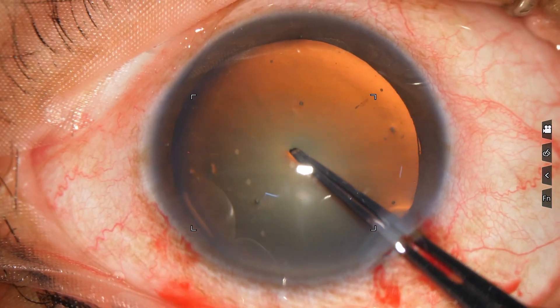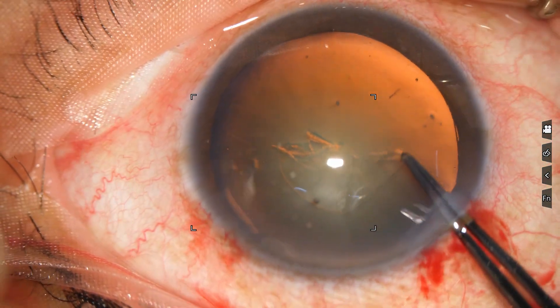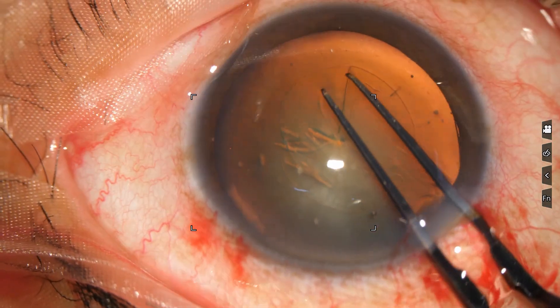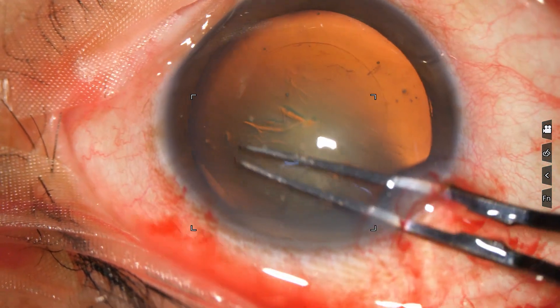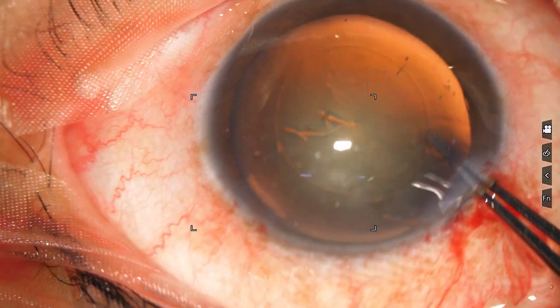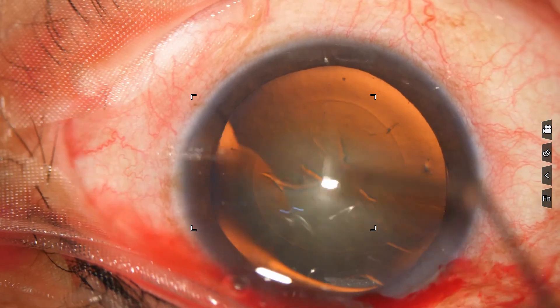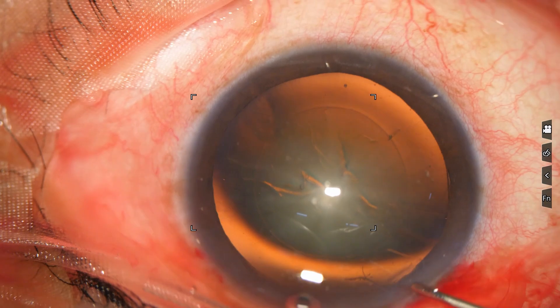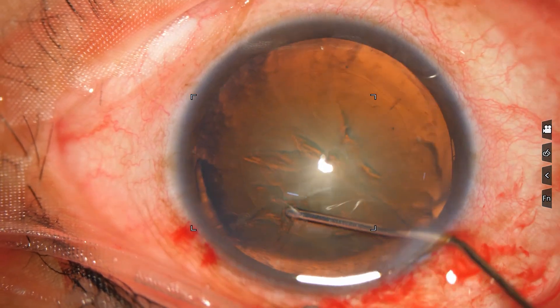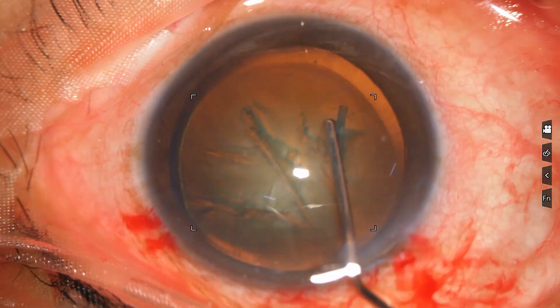Capsulorhexis is done with the help of Utrata forceps. Size of this rhexis is about 5 millimeters. Nowadays, if the zonule is okay, I can do the rhexis without use of a cystitome. The rhexis forceps directly pierces the center of the capsule, a capsular tag is raised, and rhexis is completed.